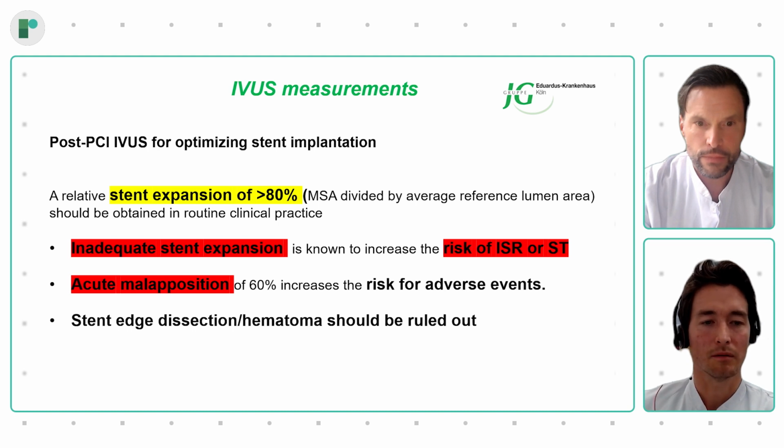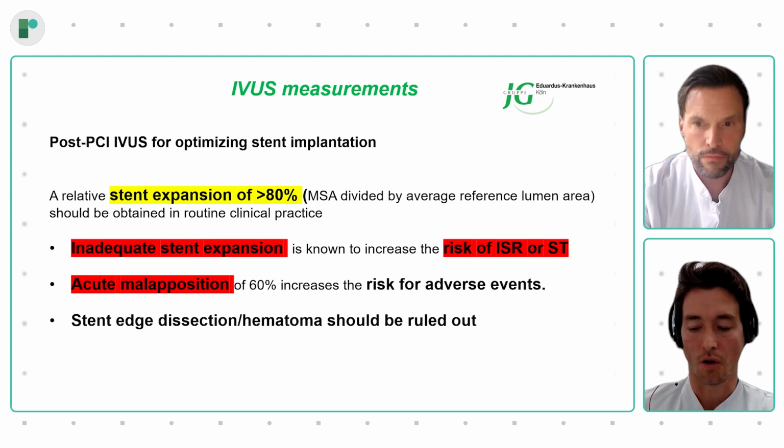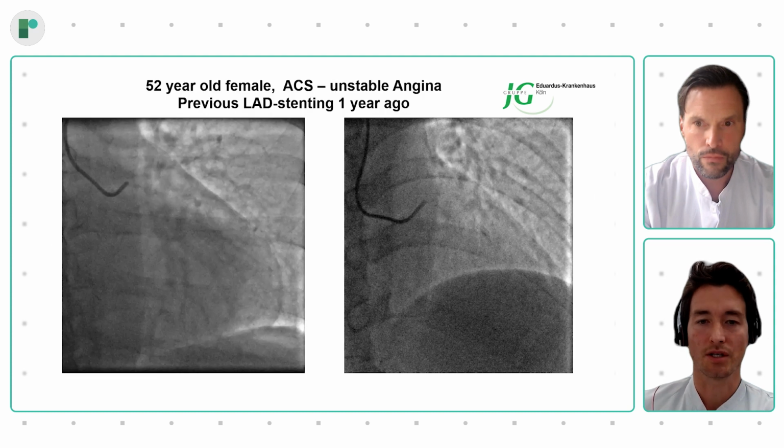Post PCI, you should also make sure there is no stent edge dissection or hematoma before finalizing the procedure.